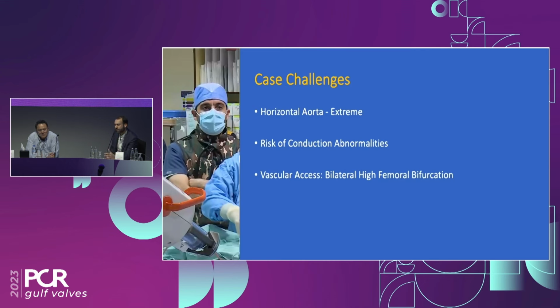So many points that you need to overcome, but with the right preparation. I think the most important thing in this case is to adequately predilate, because you have to come in a horizontal. If you're not going to predilate, you're going to get stuck.